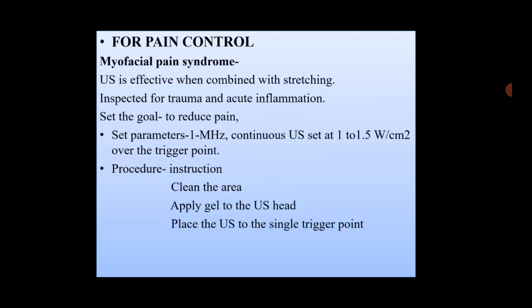So now we will see for a few conditions how we can give ultrasound. For example, myofascial pain syndrome. It is also called trigger points. The patient will be having pain on the trigger points. It is found to be effective when combined with stretching.